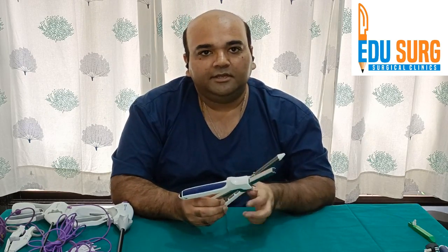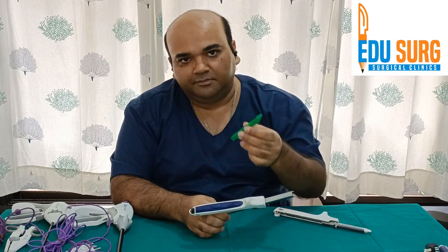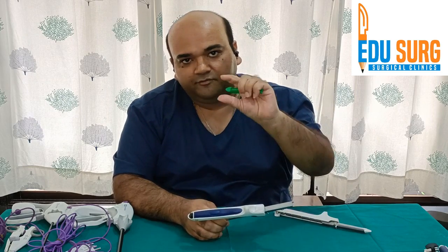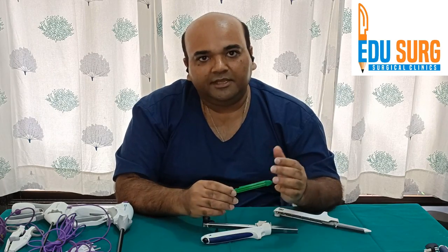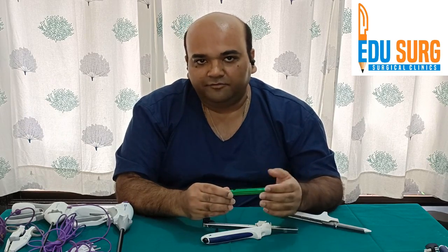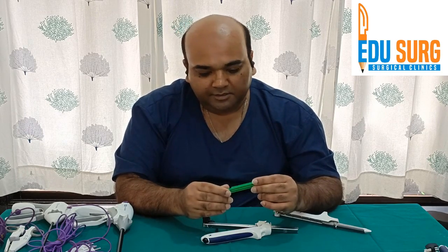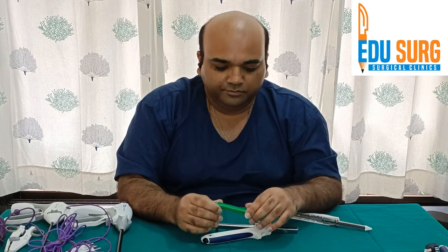As already said, the cartridges are of various colors: green is for stomach and thicker tissues, where the width of the staples is more to cover thicker tissues; blue is for bowel; white is for vascular; and black is used for pancreatic transection. Universal staplers are now available but are more commonly seen in laparoscopic staplers, which we will see in another part of this video. Thank you.